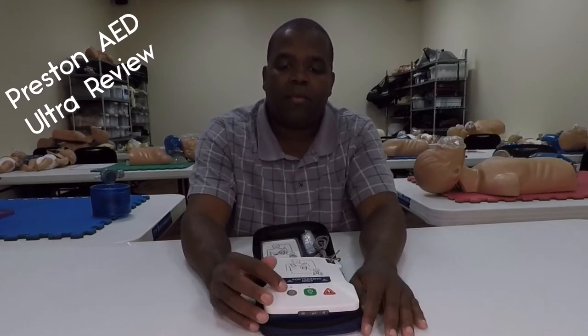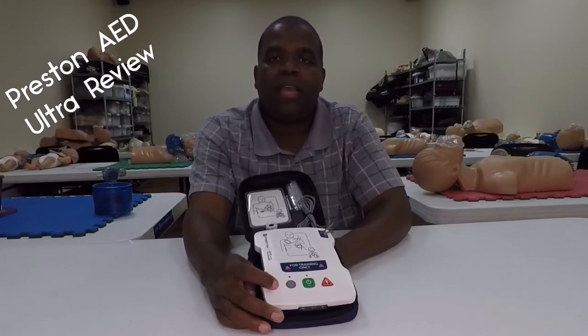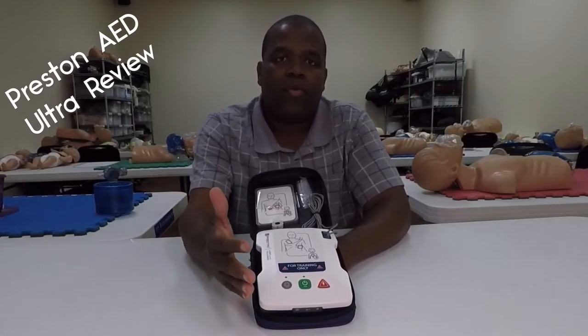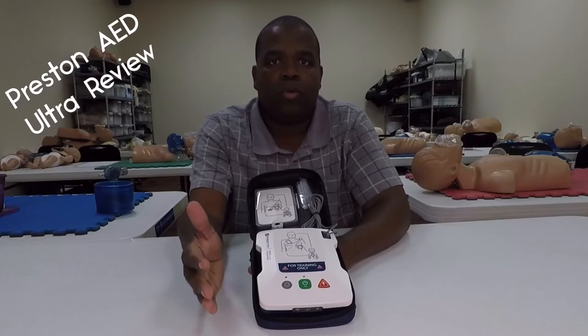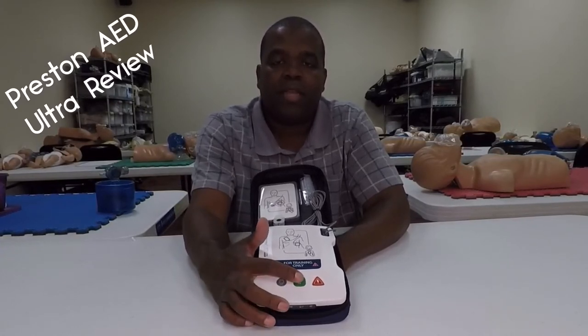There's a power button here, a shock button here, and wait a minute — we've got an extra button right here. So let's go ahead and jump into what that little extra button does. That extra button saves you the trouble of having to go back and forth whether you're going to be doing child or adult training, whether you're going to have to connect different pads. So let's jump in and take a look.